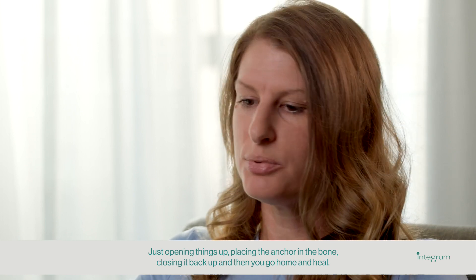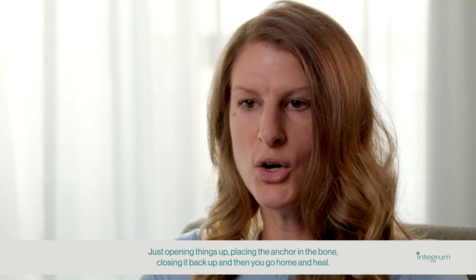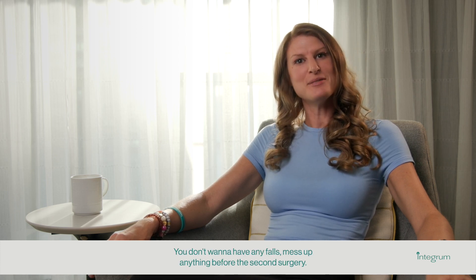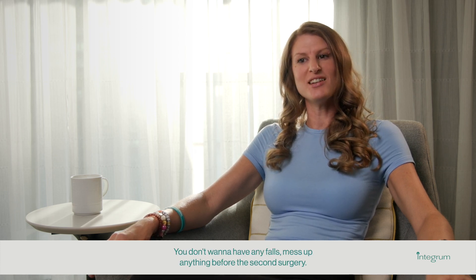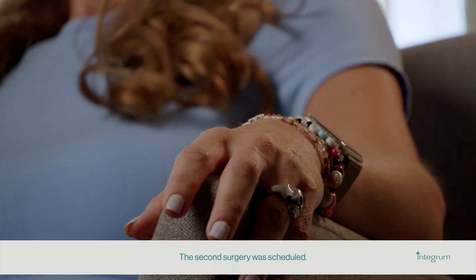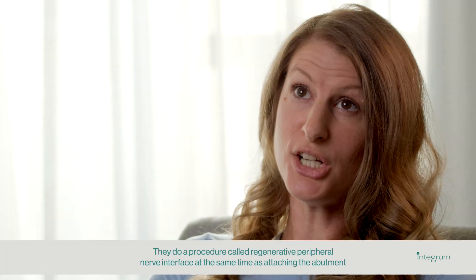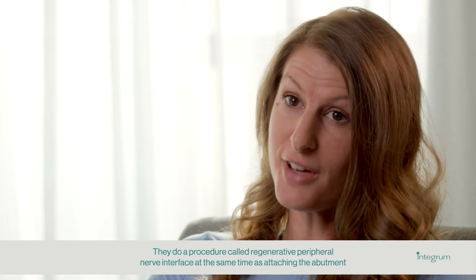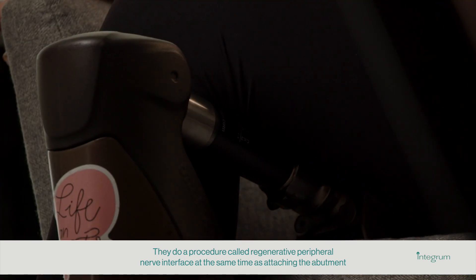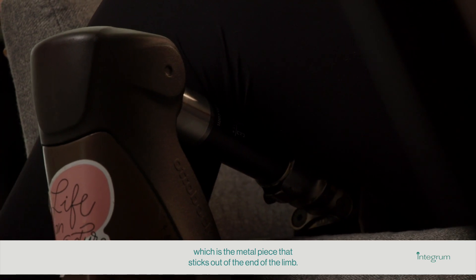This surgery was very similar to a revision surgery — just opening things up, placing the anchor in the bone, closing it back up, and then you go home and heal. During that time you have to be careful; you don't want any falls before the second surgery. The second surgery included a procedure called Regenerative Peripheral Nerve Interface at the same time as attaching the abutment, which is the metal piece that sticks out of the end of the limb.